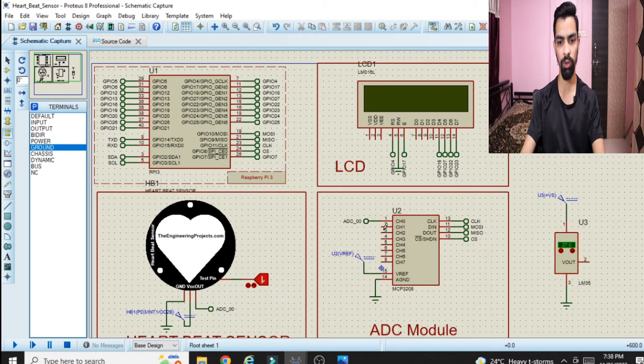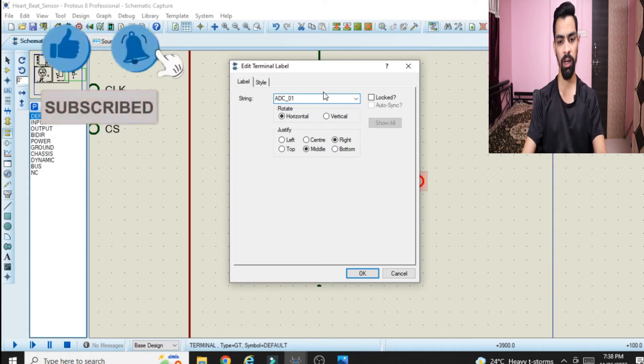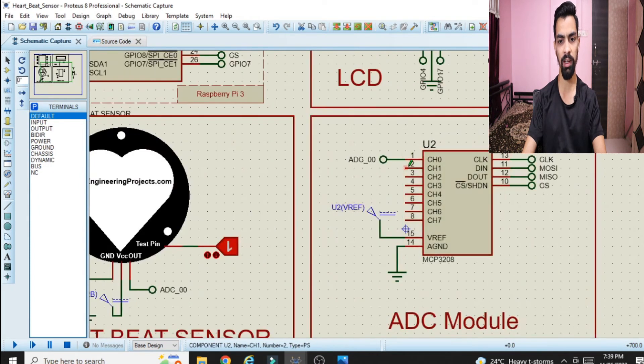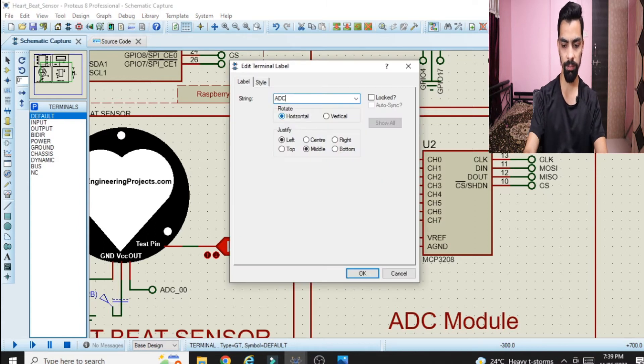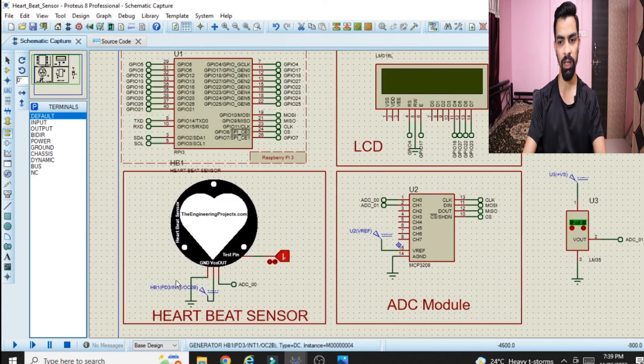The second pin of the LM35 should be connected to channel 1 of the ADC module. Go to terminal mode, click on default pin, place it and rotate 180 degrees, then connect it to pin 2. Double-click the pin and name it 'ADC_01', then click OK. Again go to terminal mode, place another default pin and connect it to ADC channel number 1, naming it 'ADC_01' — the same name as on the temperature sensor side.